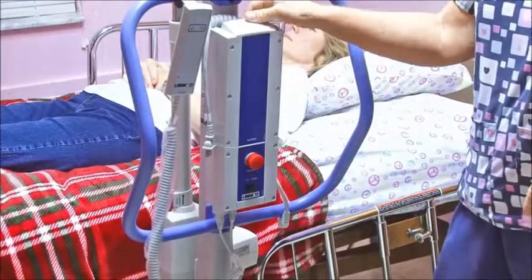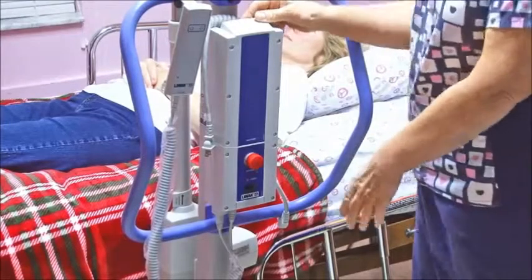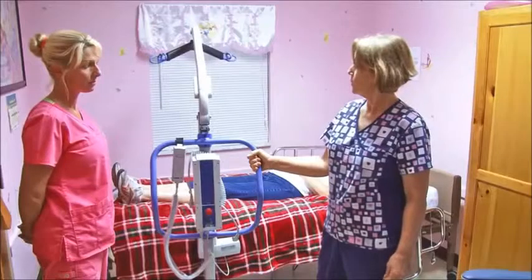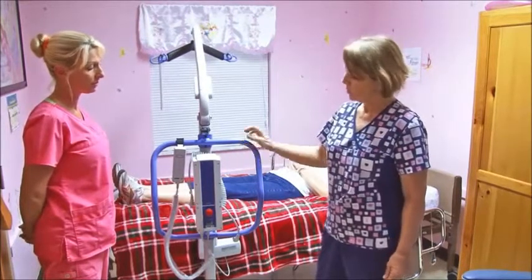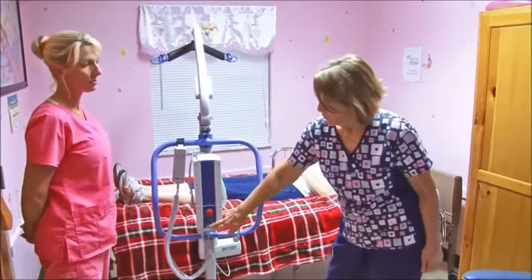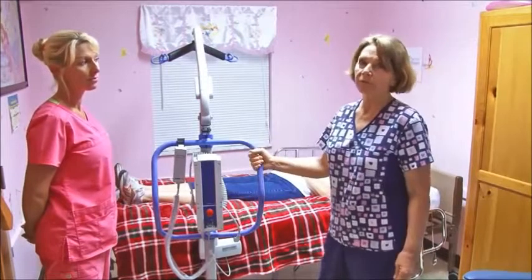The battery pack is all the power, and that gets charged when it's going to be sitting. You're going to also be making sure that the sling is not frayed, and that the battery operation, that the 4 bars are there, and that you know you have a full battery.